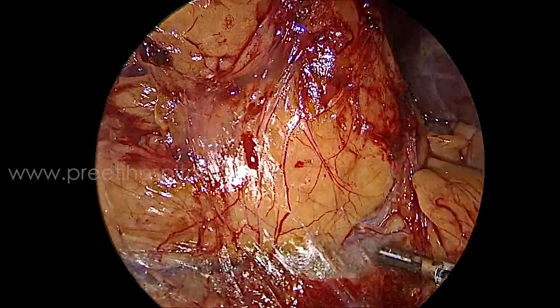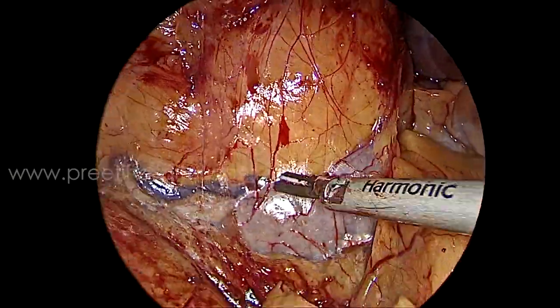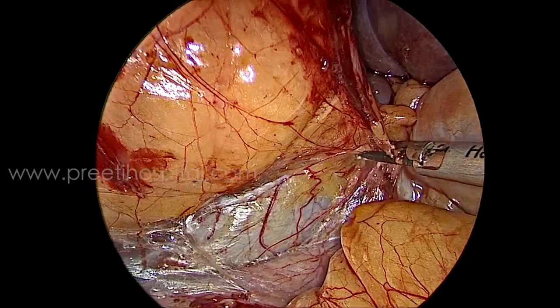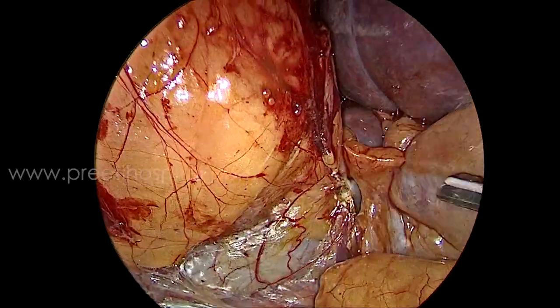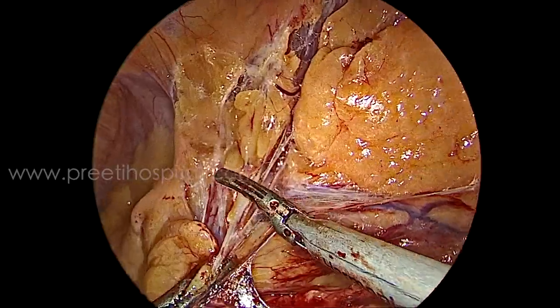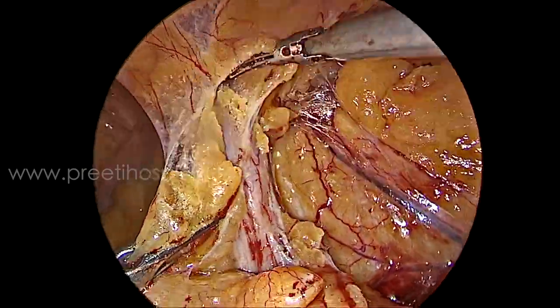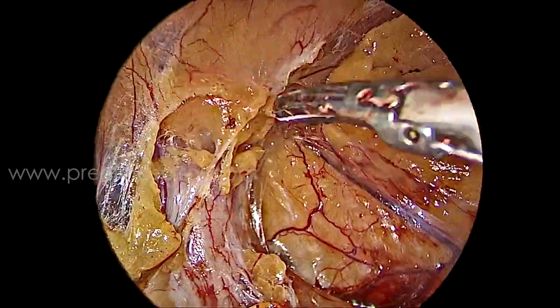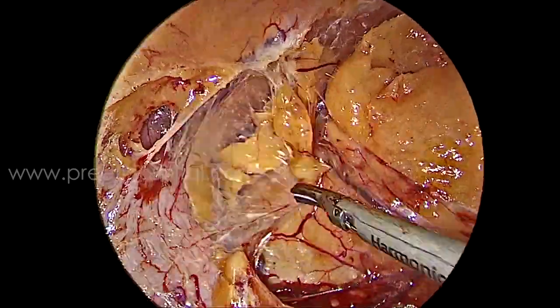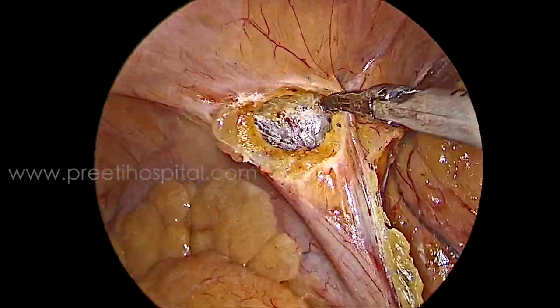We went to the duodenum and all this went well. But after mobilization of the renal vein and artery in toto, there was a lot of ooze at the renal vein region. We thought we would first see the lesion over the kidney and then decide.